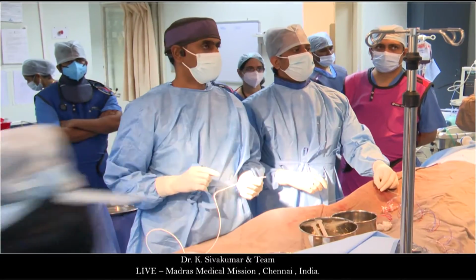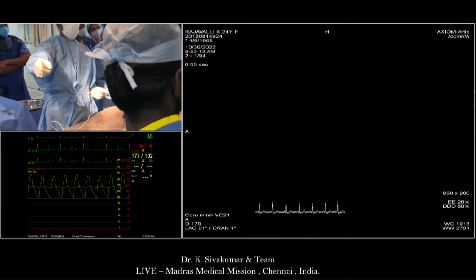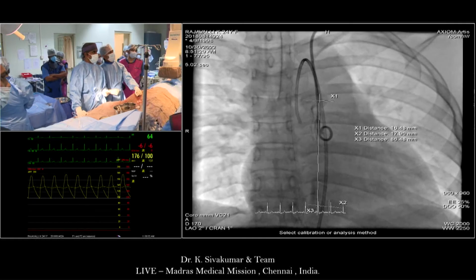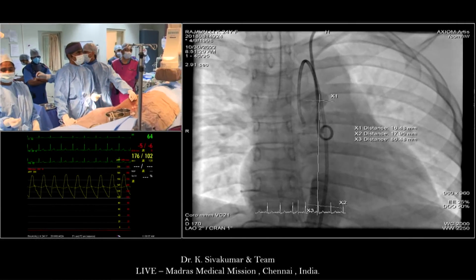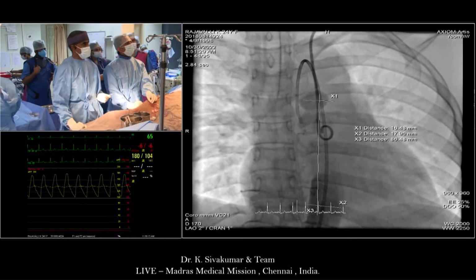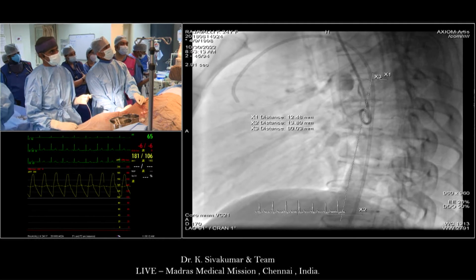Now, he was asking, show the angiogram. See, what we did today was, lateral view, show the thoracic. Yeah. So you can see that the pseudoaneurysm is overlapping on the aorta, and the aortic dimensions are around 16.5 proximally, 18 distally, with a length of 86 millimeters. I'll show the lateral view. So the lateral view shows that large pseudoaneurysm that is protruding.